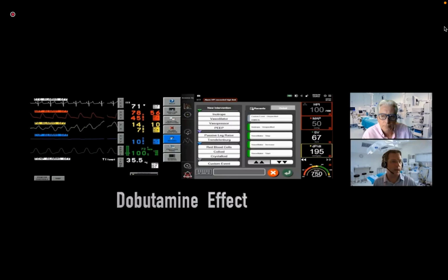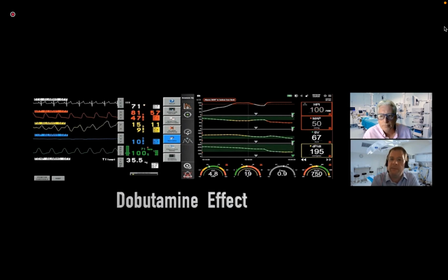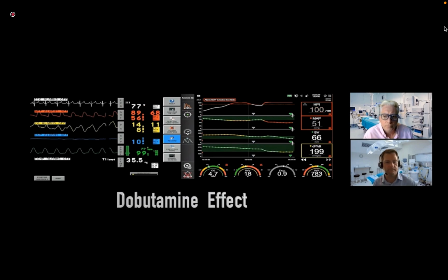So we've looked at negative inotropy, so let's have a look at positive inotropy and see whether DPDT reflects changes there. If we run the model now, we'll start some dobutamine, a positive inotrope, and from giving dobutamine we should expect some increase in inotropy. So DPDT should go up from the baseline that we see there of 195, and we would also expect an increase in our heart rate as well. Baseline heart rate there, 71. So that should increase with dobutamine infusion as well.